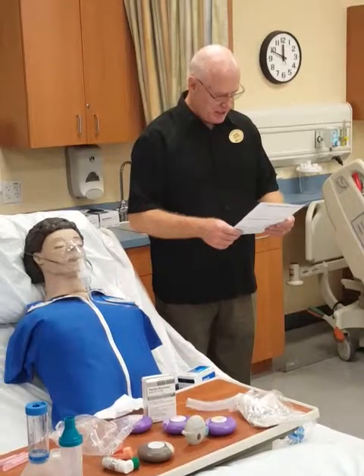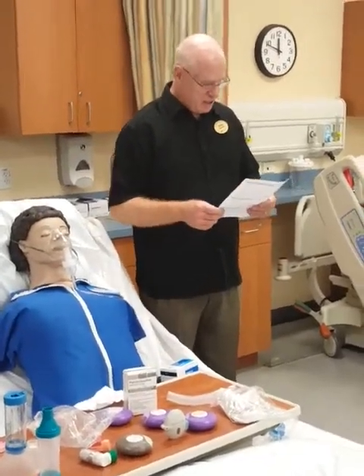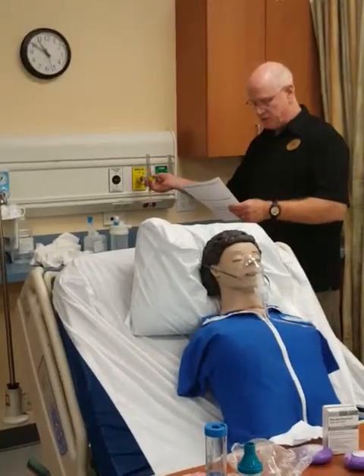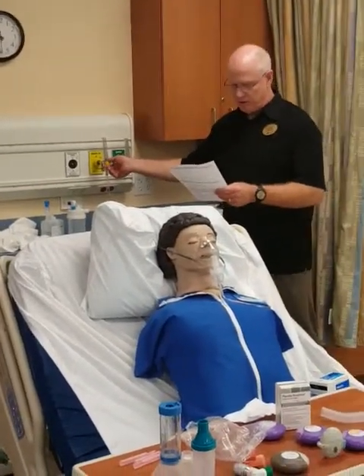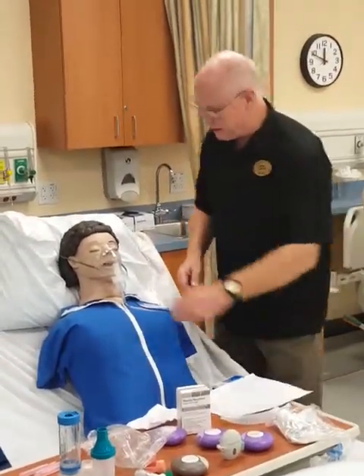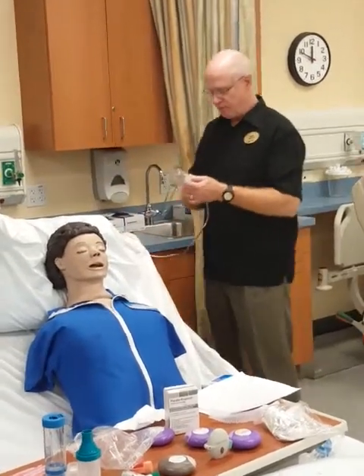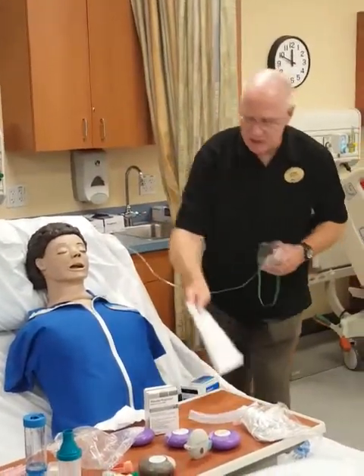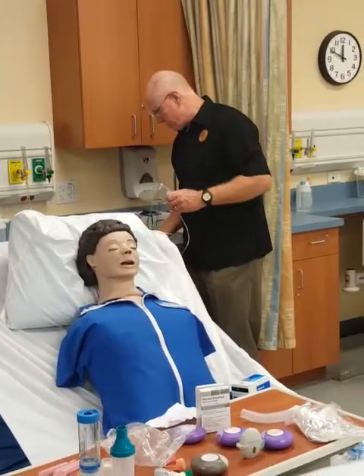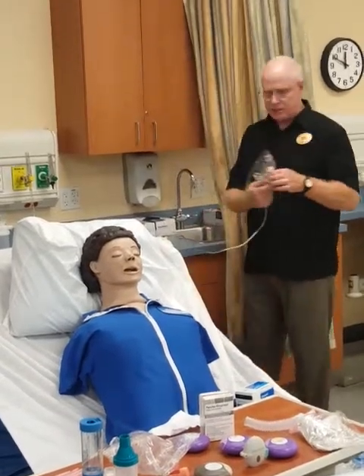Verbalize how you know the treatment is finished: it's sputtering or it stops nebulizing. Then turn off the gas flow, remove the small volume nebulizer mask, reassess the patient, and place the patient back on the prescribed oxygen — that's an important part. If the patient was on oxygen, put them back on oxygen. Empty the small volume nebulizer of residual medication.